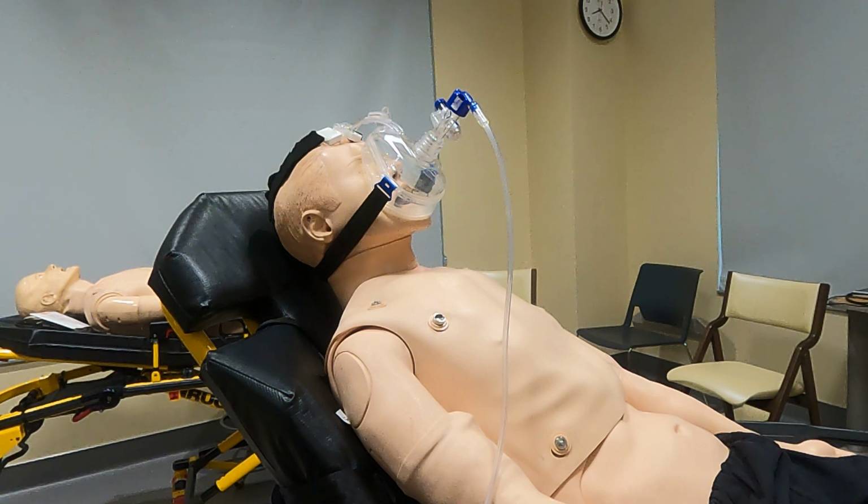So once it's on, call the hospital, let them know that you have a patient who's on CPAP. That way, when you get there, hopefully respiratory will meet you in the room and they can switch to their device. All right, that is CPAP.